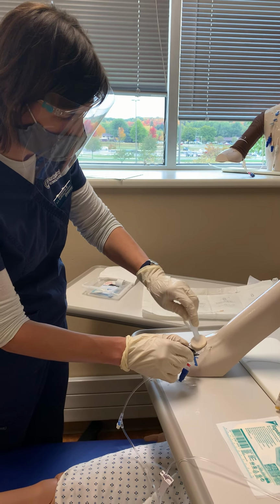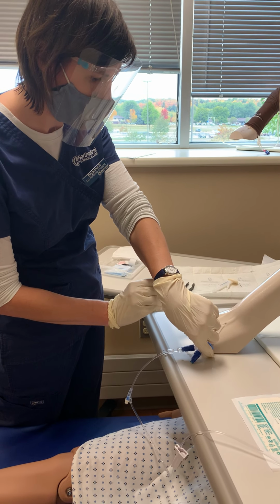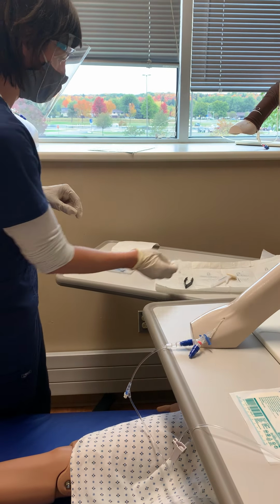And I'll get my skin prep. I will open it up. And my antiseptic has dried. I'm just going to go in a nice square around. I'll get underneath here carefully so that I'm not moving and pulling the PICC off. Okay, so we are now prepped with the skin prep. I could take my gloves off at this time, but I'm not. I'm just going to leave them on.